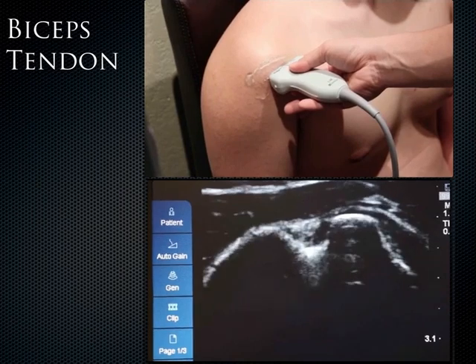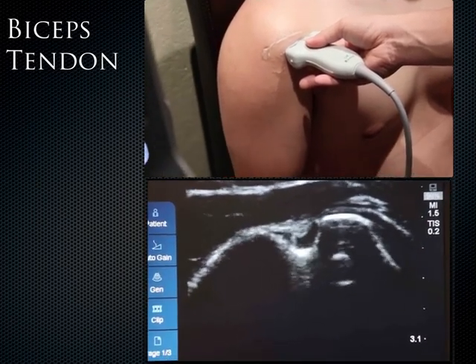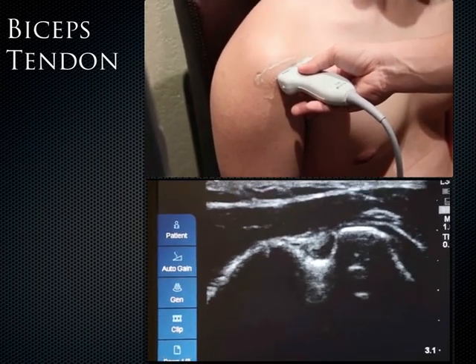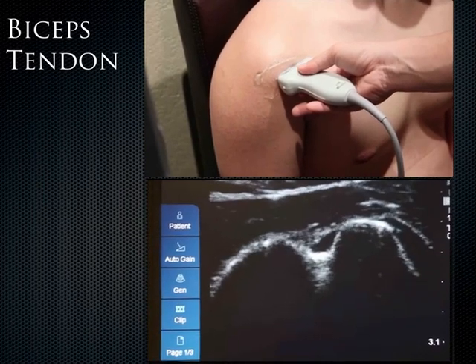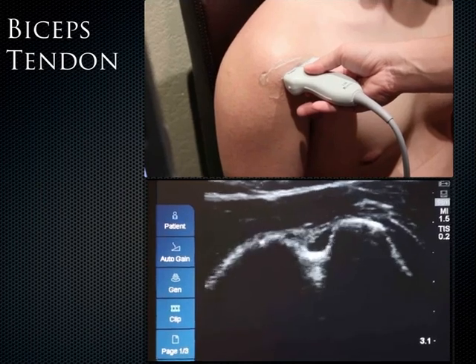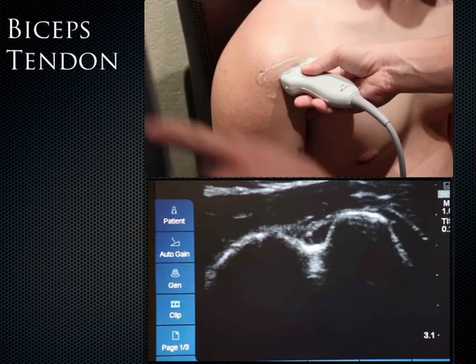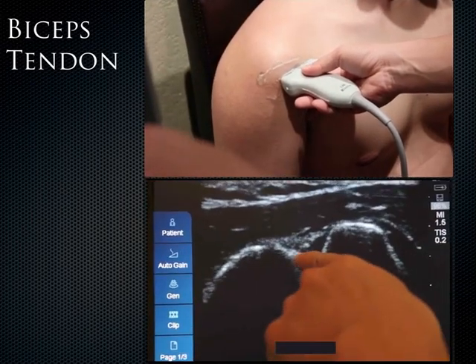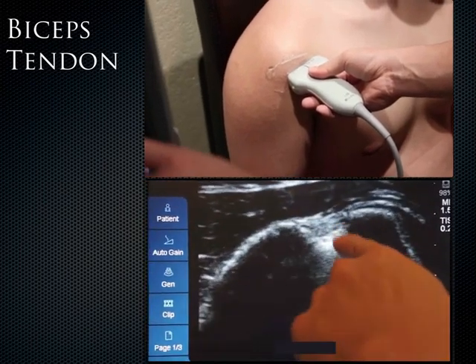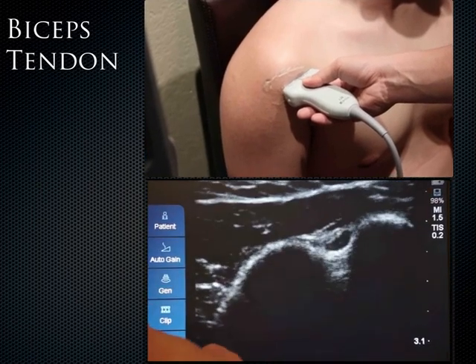The structure that I'm interested in is the biceps tendon in the bicipital groove. I'll put the probe in a transverse orientation with the indicator pointed laterally, depending on which shoulder it is. What I first identify on the ultrasound image is the greater tuberosity on this side, and then the lesser tuberosity here. In the middle, you have this anechoic structure, but if I fan the probe this way, it becomes very bright, and that's the biceps tendon in the bicipital groove.